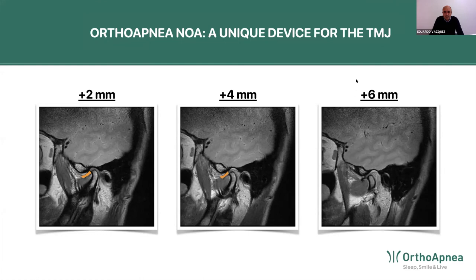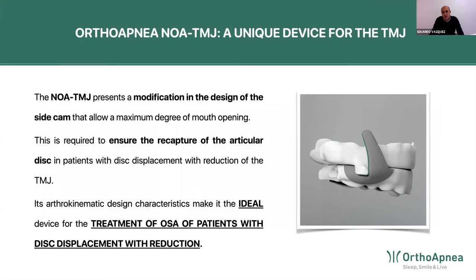Now, for the treatment of patients that have painful clicking of the temporomandibular joint, they have what we call disc displacement with reduction, sometimes even with intermittent locking. Sometimes the patient gets locked and is not able to open the mouth. Sometimes the patient is able to make the click and open the mouth. In these cases, we can treat both disorders, the sleep apnea problem and also the temporomandibular joint disorder, with the use of the MAD. We've already treated around 30 patients with combined problems, very successfully.